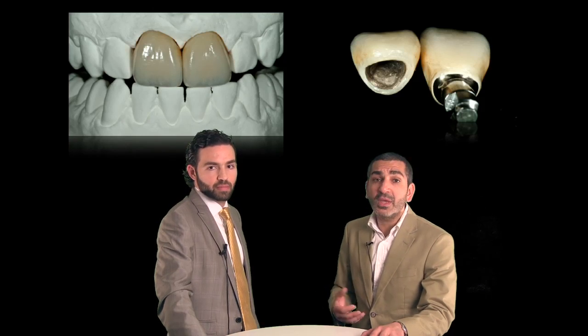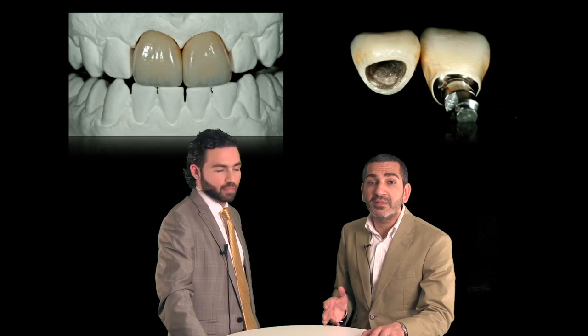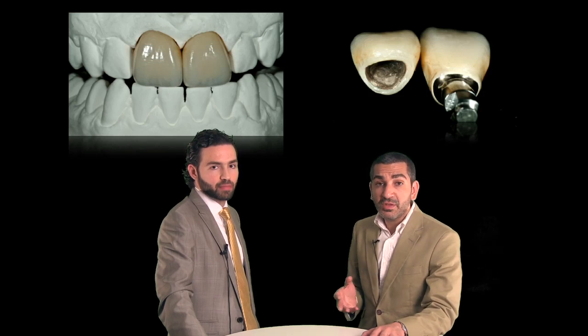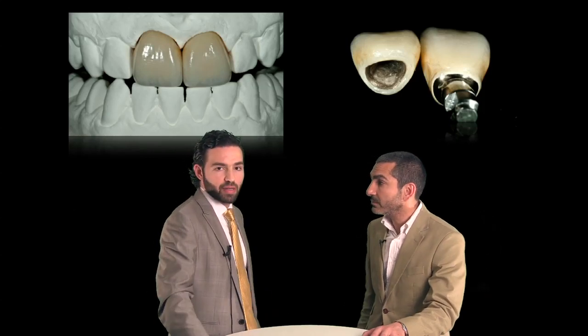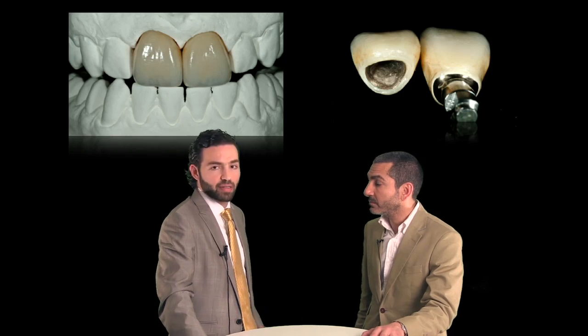We have the strength, we have the aesthetics, and we have the function, and we have the predictability with these type of restorations. And because both the substructures are the same material, it is easy. It can be done at once. So life is a lot easier and a lot more predictable because we know what we're doing, and cementation is also easier, isn't it? Yes, absolutely. You just have to cement it. You don't have to worry about bonding or any of that. It's much more easier, technically speaking.